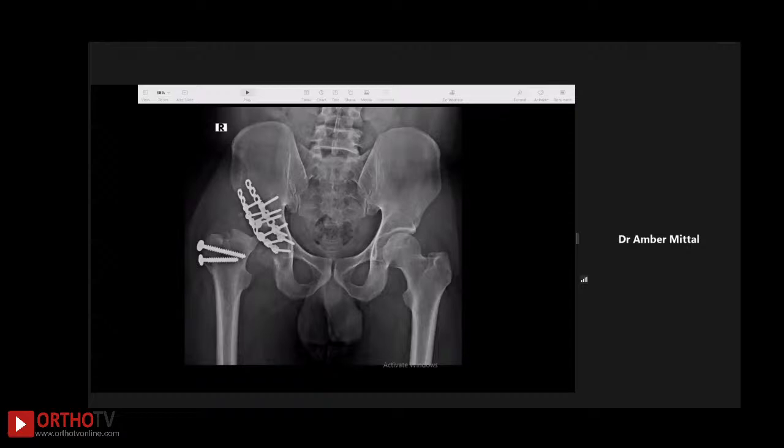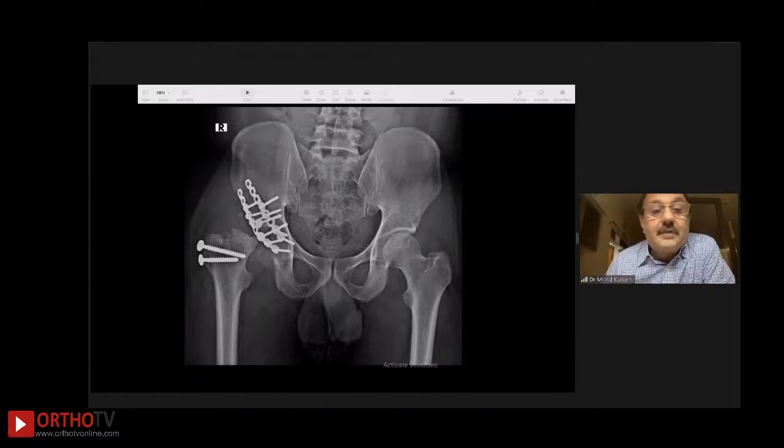This is a 35-year-old male operated six months back. He came to me like this. Both column fracture. Probably the surgeon had done a trochanteric osteotomy. Why, I don't know. But the worrying part is, where is the head? So the first thing I thought of was infection: major surgery, dual plating, infection.